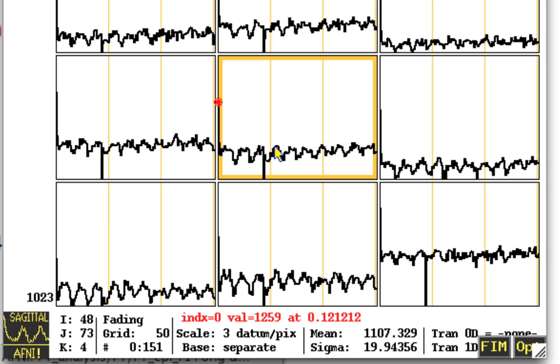Okay, notice that these first two TRs, I'm clicking the left and right arrow keys, are relatively high compared to everything else. Okay, so this value right here, it should be around 1,000 for most of these TRs, just for this subject. It's a kind of an arbitrary value. But notice that the first two are relatively high. Recall that we wanted to chop off those first two TRs because we hadn't reached a steady state yet. So that's why we did that command.